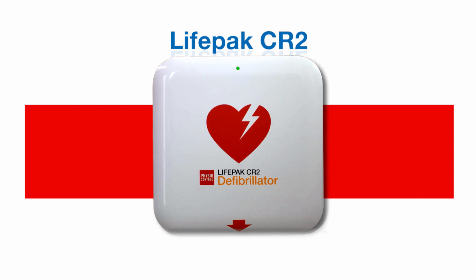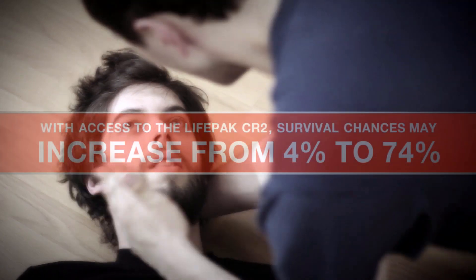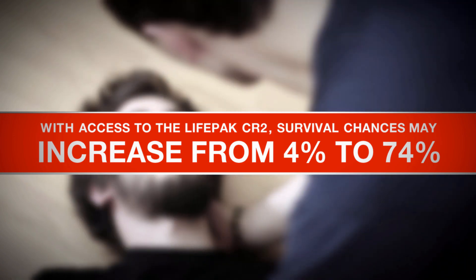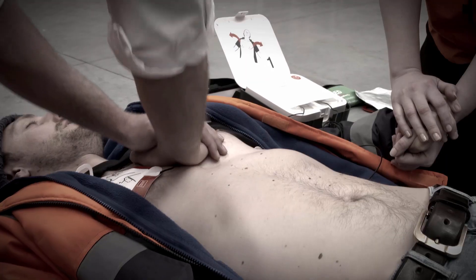The LifePak CR2 is the latest and most technologically advanced defibrillator on the market. This AED brings you one step closer to saving the life of a friend, family member or colleague. The LifePak CR2 is simple and easy to use, even by an untrained bystander. Within three minutes of someone suffering a cardiac arrest and with access to the CR2, survival chances may increase from 4% to 74%.